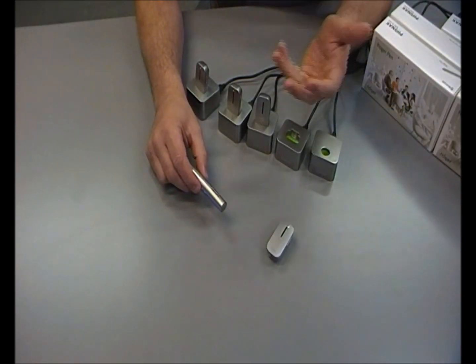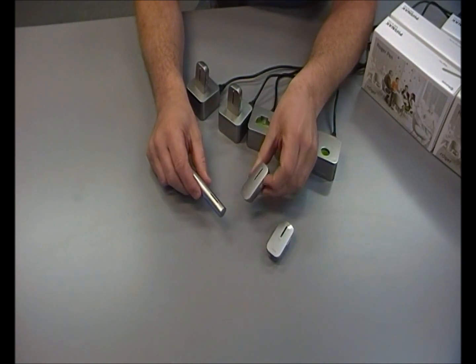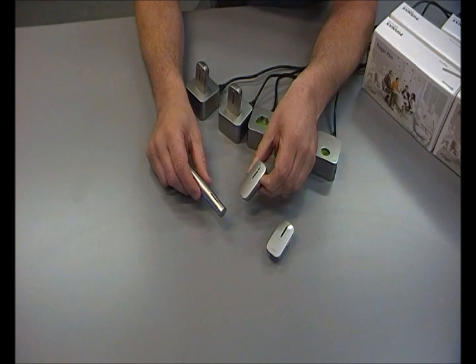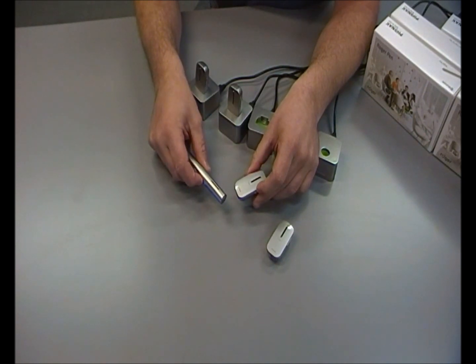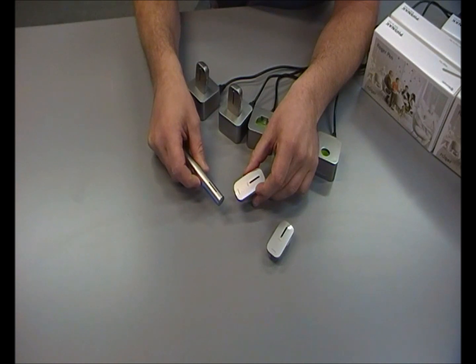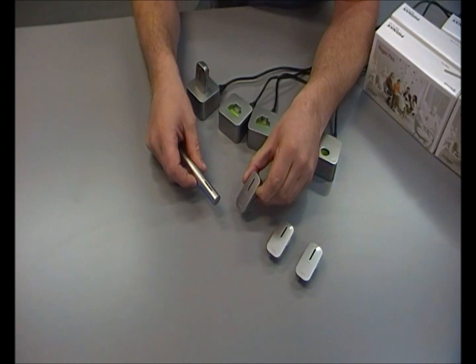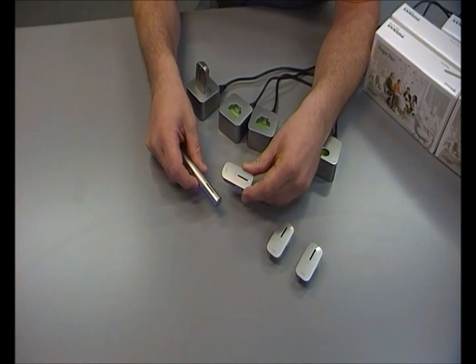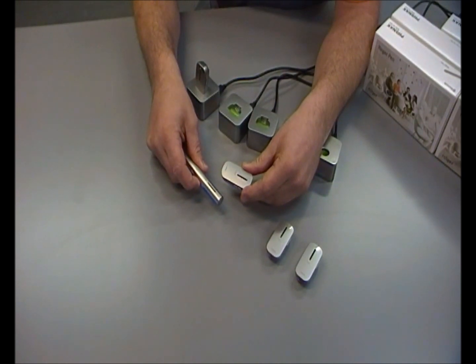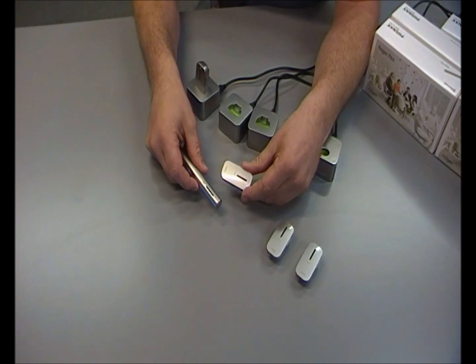We can now continue adding as many microphones as we like to the network, and it's as simple as following that same step. Turn on the clip-on microphone, wait a few seconds, and using the Roger pen, press the connect button. A green light indicates that the pairing has been confirmed — that's my second clip-on microphone. I'm now going to add a third clip-on microphone, again pressing the connect button on the Roger pen.